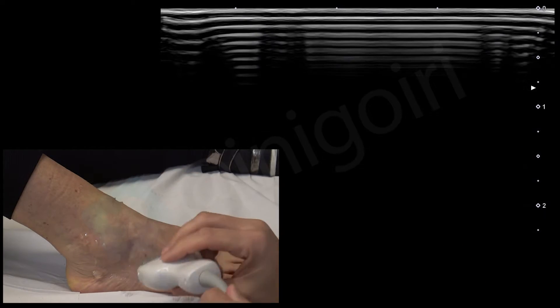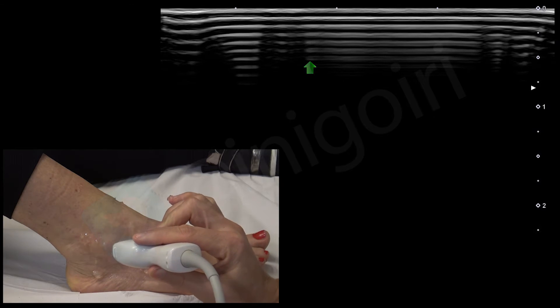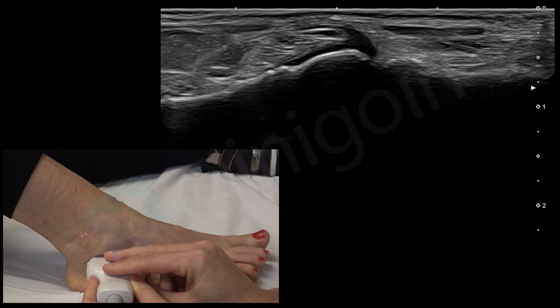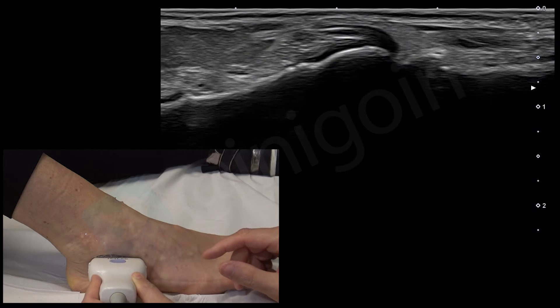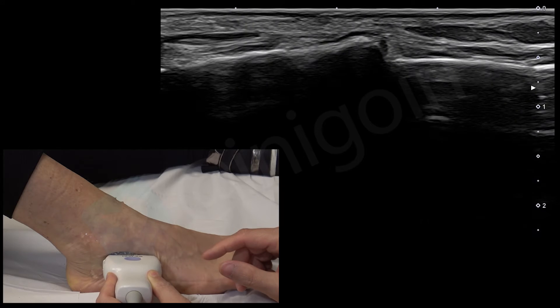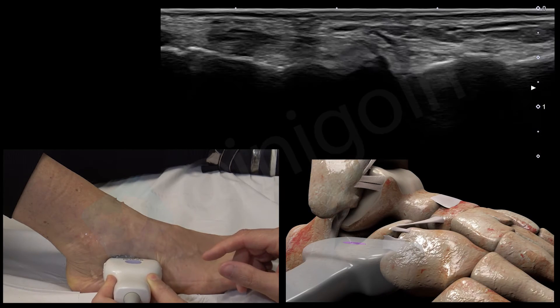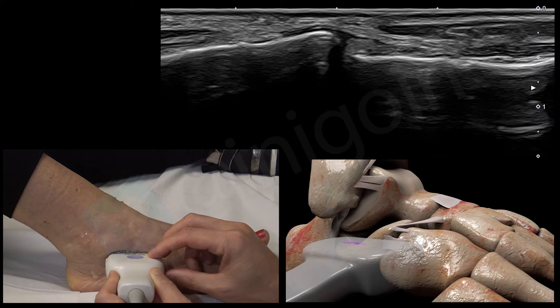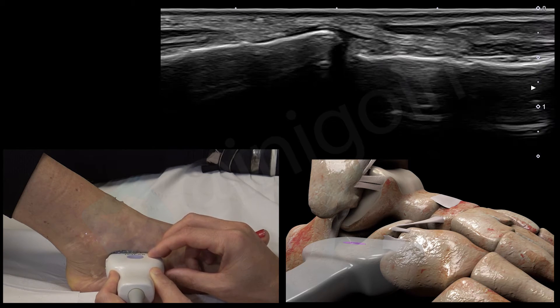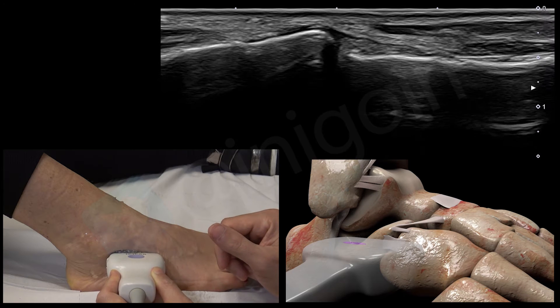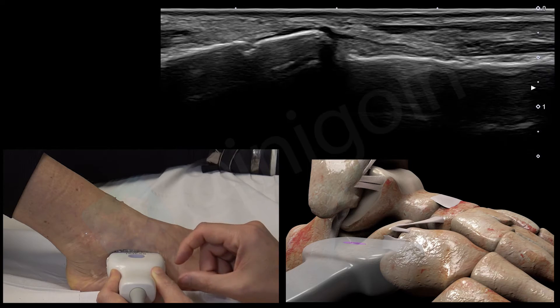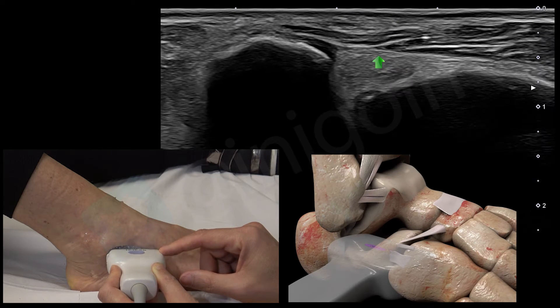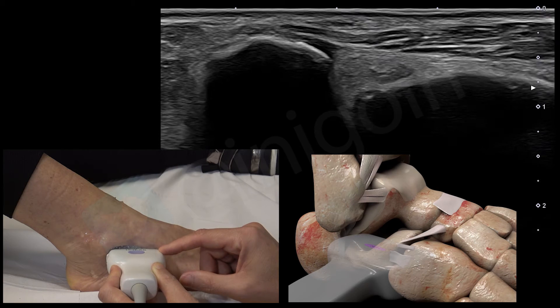Now we are going to check the dorsal calcaneocuboid ligament. We place the probe over the calcaneus until we have a nice view of the cortical here, and we move the probe distally to the joint between the calcaneus and the cuboid bone. We then move slightly upwards until we see this very thin ligament between the calcaneus on the left and the cuboid on the right — this is the dorsal calcaneocuboid ligament. If we continue upwards, we'll notice another very subtle ligament, which is the calcaneocuboid component of the bifurcate ligament.